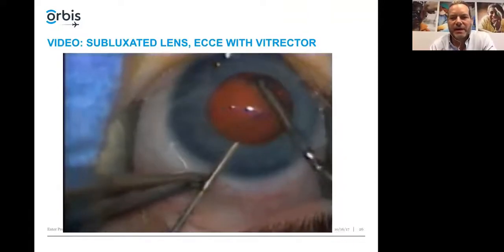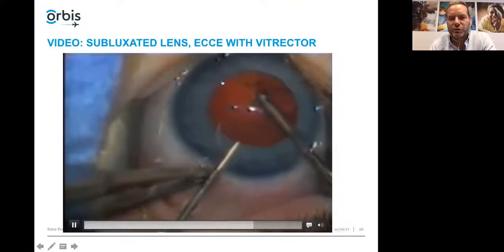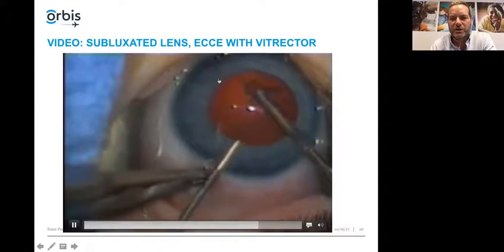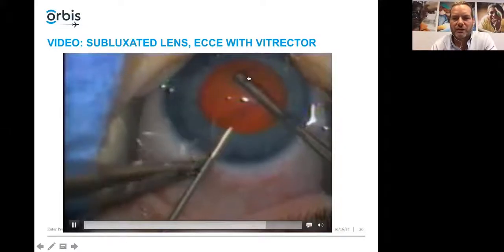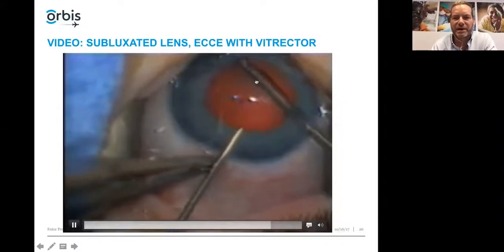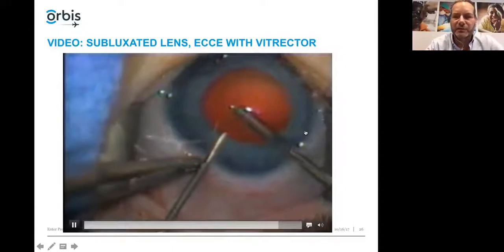As you go back to the cutting, you have to be careful, especially when working over here, because this is the hardest part along the iris edge to get that last little bit of capsule remnant. You don't want to get the port of the vitrector up against the iris and take a bite out of it, especially on a blue-eyed patient, because it'll be quite obvious externally from a cosmetic standpoint.